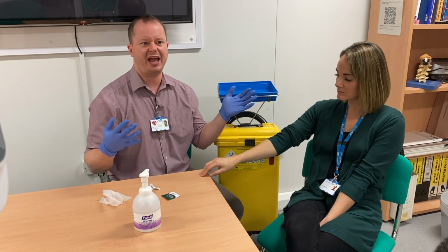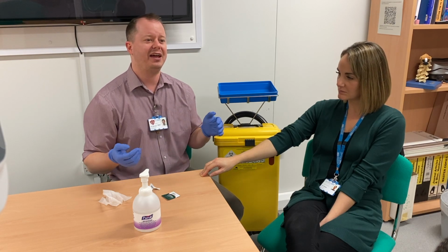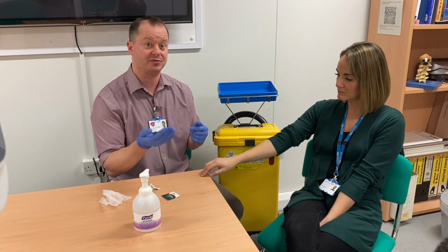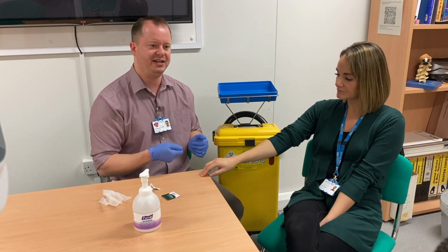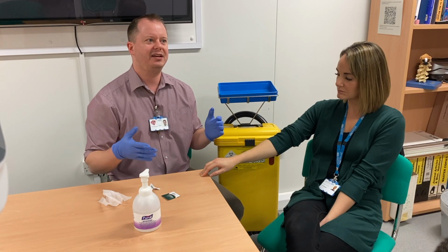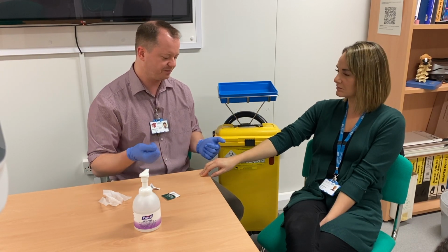Once you've cleaned the skin, the alcohol itself only really kills the bacteria when it's dry. And if you do get alcohol into a cut, which I'm sure you've realised already, that really hurts. Also the alcohol of the wipes can damage the blood sample if it gets onto the blood sample. So essentially, it's really important to make sure the alcohol's dry before you actually stick the needle in the vein. Because if you don't, it hasn't worked, it will hurt the person, and it might damage the blood sample you're taking, so it'll make it completely pointless.